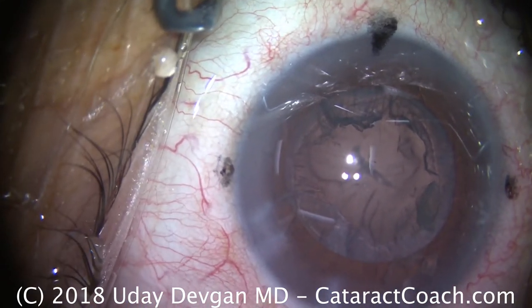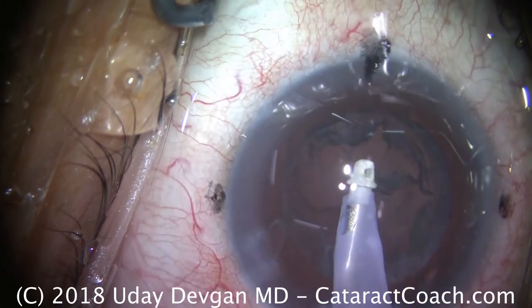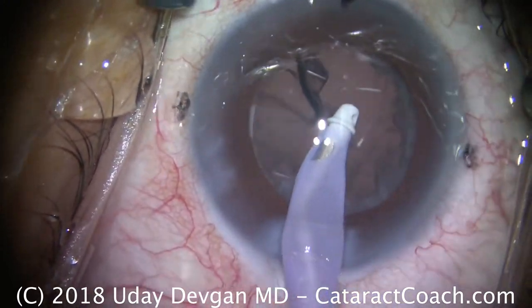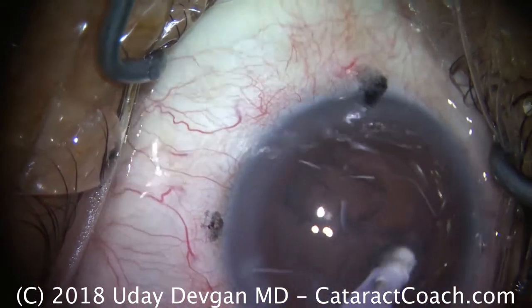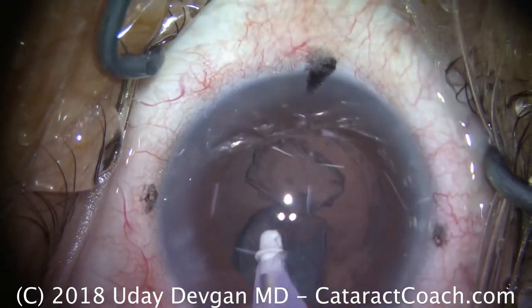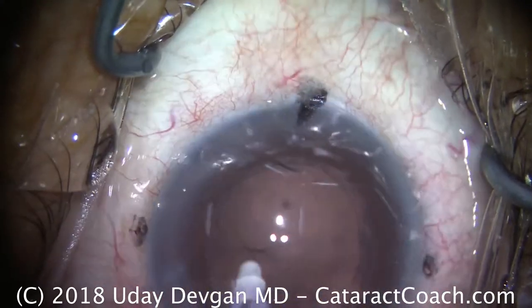We're switching to the irrigation-aspiration probe to remove the lens cortex. We'll place the I&A probe inside the eye. There are a few small fragments to remove, and we'll take away the cortex nice and slow in a circumferential manner. The eye stays in primary except in the sub-incisional space, where it's okay to bring the eye out of primary in order to access that sub-incisional cortex. There's a big removal of a sheet of cortex, and the eye's looking pretty good. We'll do a little polishing of the posterior capsule as well, making sure we've gotten out the vast majority of all the epithelial cells from the lens and cortex pieces. That looks great.